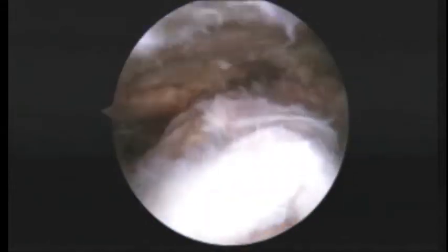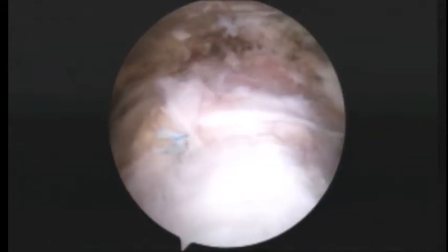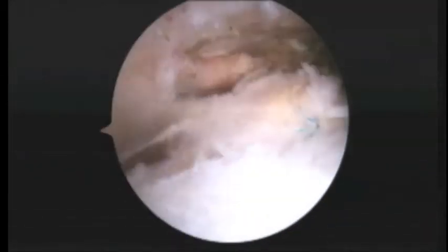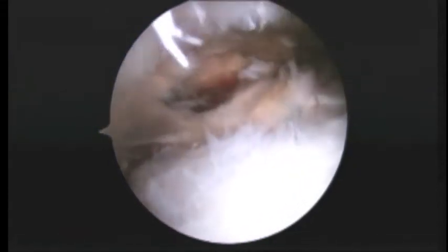We also did our side-to-side stitch already. You can just see the blue and white suture there. So we've got a side-to-side kind of ripstop stitch. And in just a minute, we'll show you how we pass our next stitch. Pause, please.